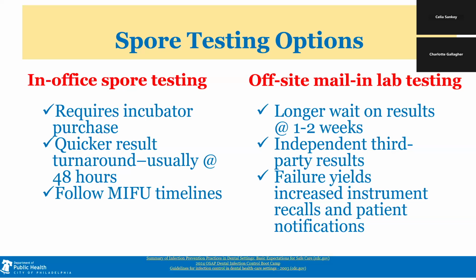We have options here. Spore testing may be completed in office, which will require the purchase of an incubator, but gives a quicker 48-hour or less response to indicate failed sterilizers. Consequently, there will be an improved rate of sterilizer replacement or repair. The number of instrument packs that should be recalled and the number of patients potentially exposed is also reduced.